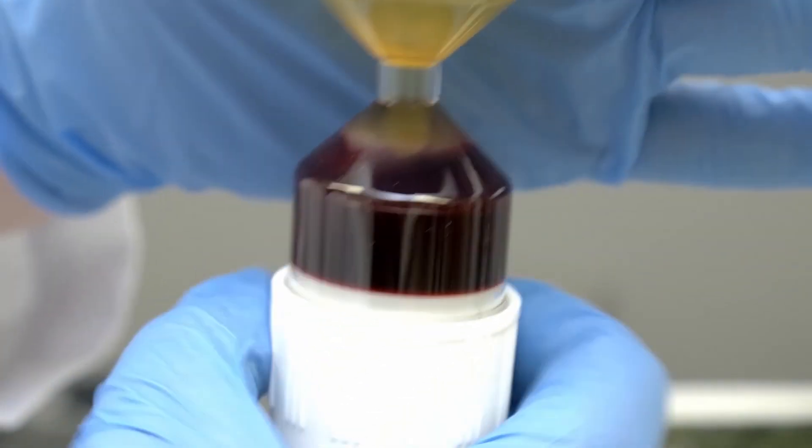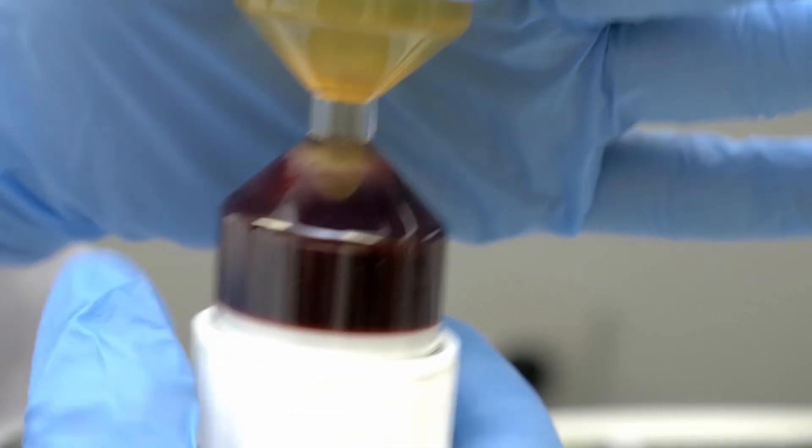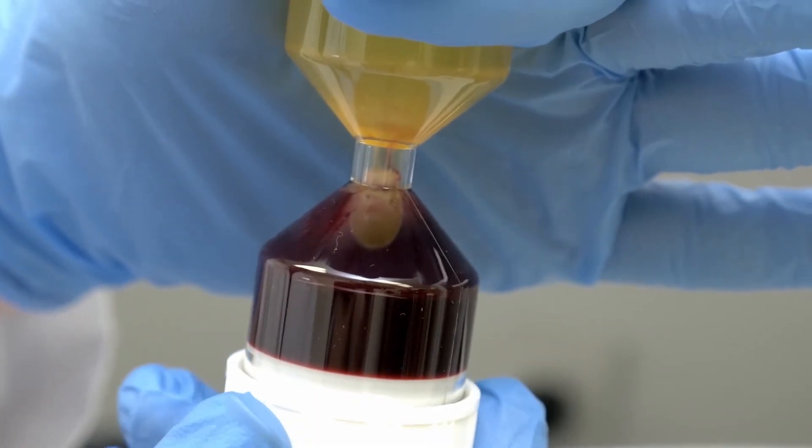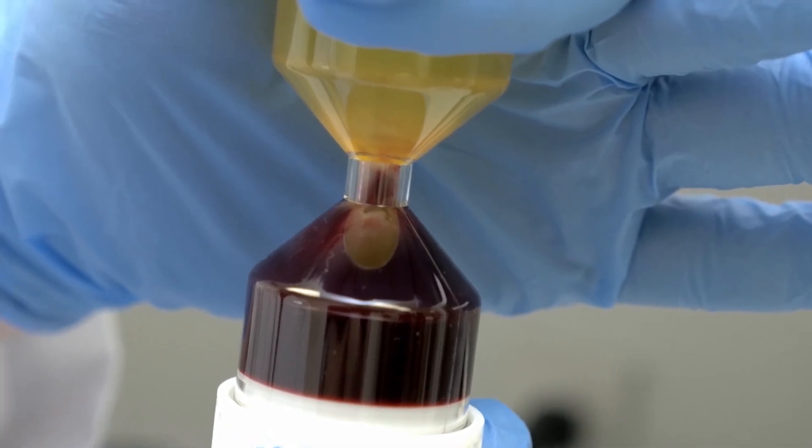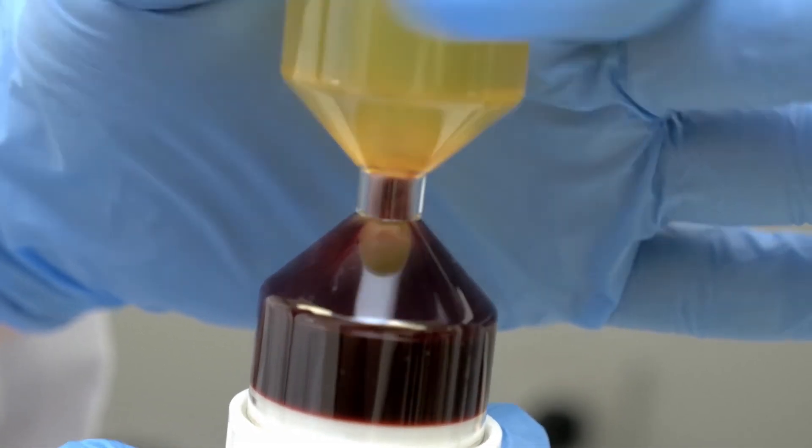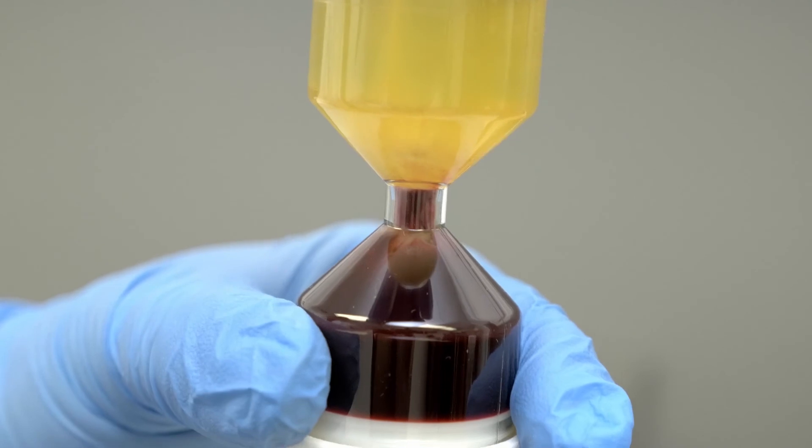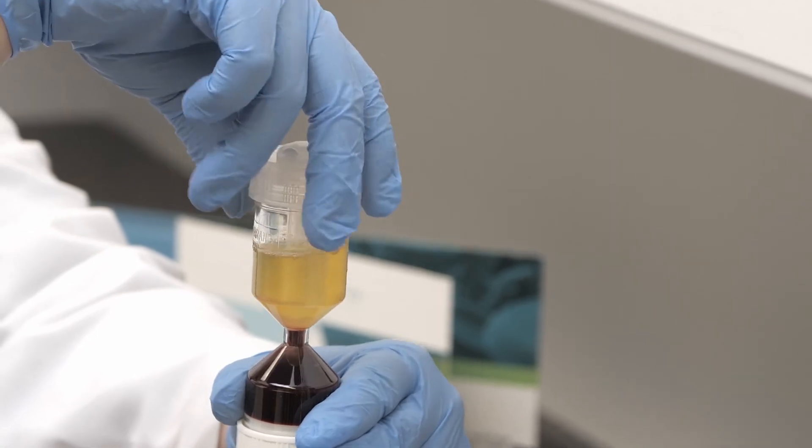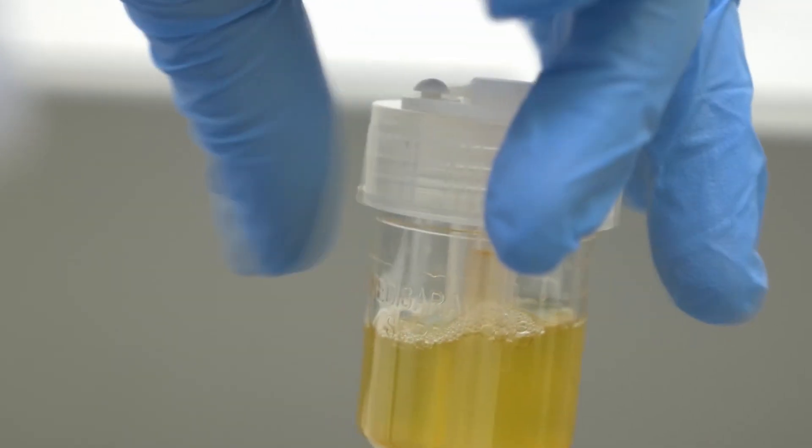Rise the red blood cells and buffy coat by turning the bottom collar counterclockwise until the buffy coat has reached the neck of the World PRP tube. Slowly turn the bottom collar until the buffy coat has been transferred into the top chamber leaving the red blood cells in the neck of the tube. Turn the collar clockwise to seal off the connection between the top and bottom chambers.